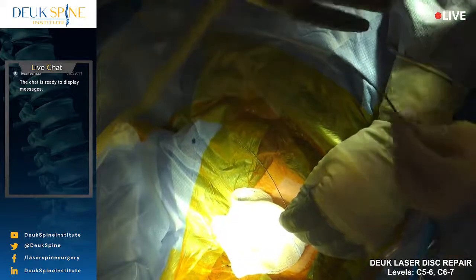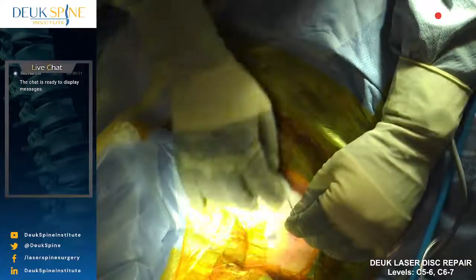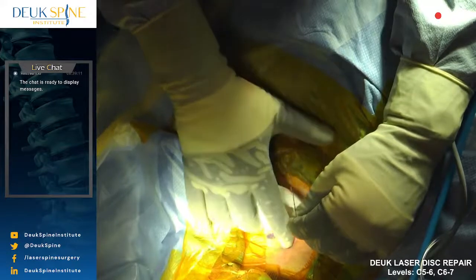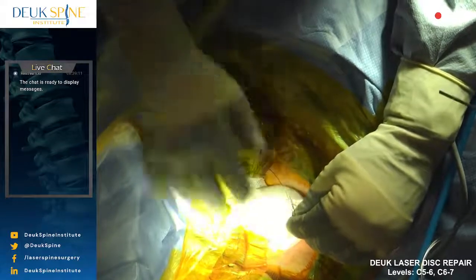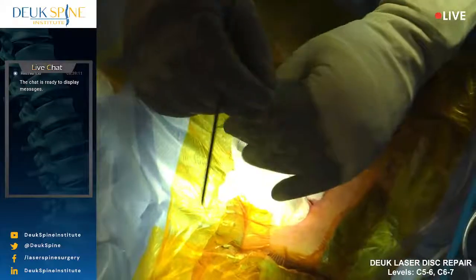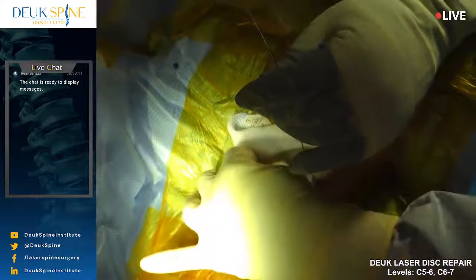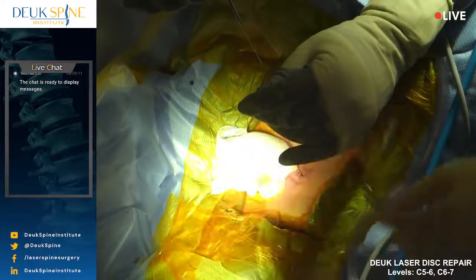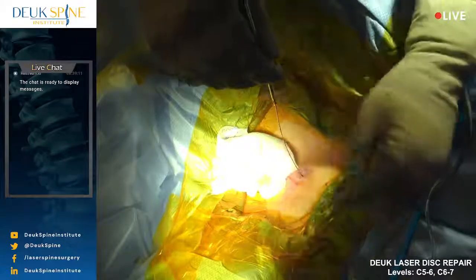Before I do that, everyone take a look. Can you see this incision, Diego? Yes, we're seeing it. That's a 4mm incision, virtually bloodless surgery. I'm going to bring this dilator down over the guide wire. And I'm using the guide wire because I know that the path of the guide wire is safe.